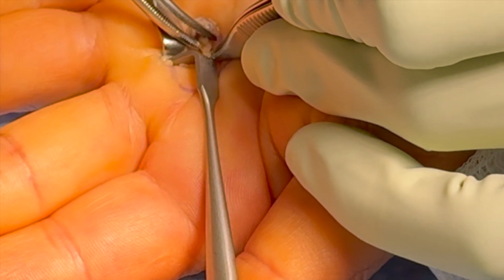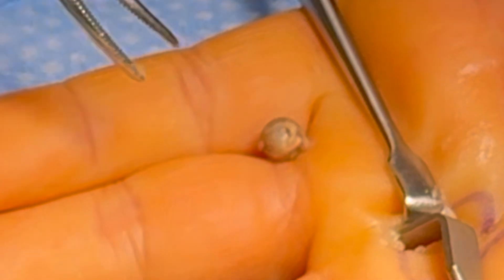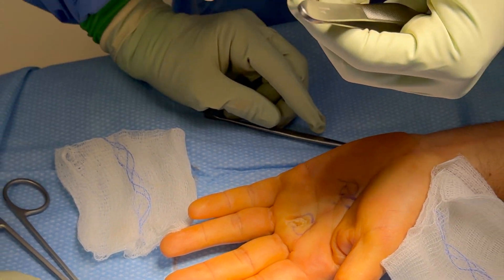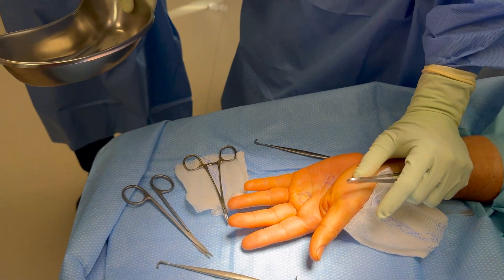You can see the pellet coming out there. Here's the pellet in all its glory — just a little BB pellet from a BB gun. And in a typical operating room tradition, we take the foreign body and bang it in a kidney basin to create a satisfying sound.